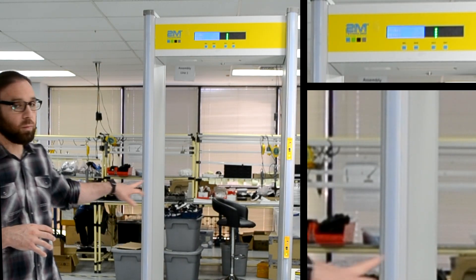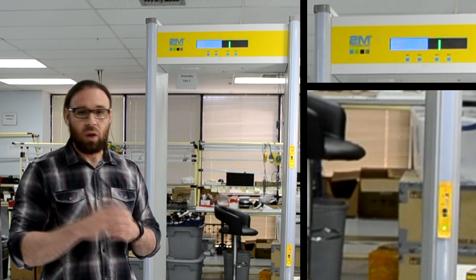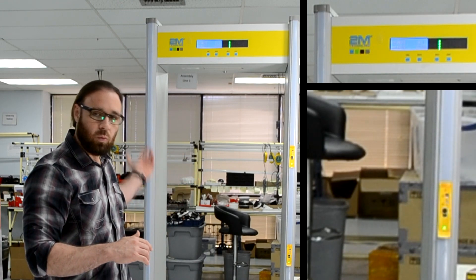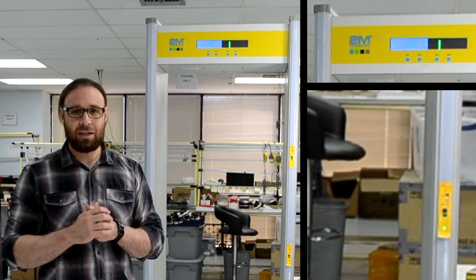As you can see, the red lit up where the cell phone was at. And that's our demo for today. I hope it was beneficial. One thing we might not have mentioned is that there are LEDs at the back, so where the security person is standing, they're going to be seeing it from the other side. Thank you very much.